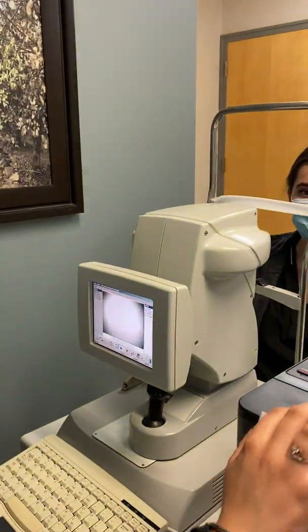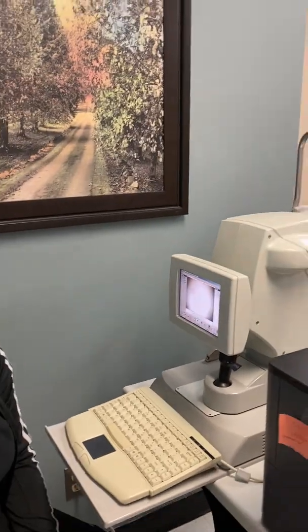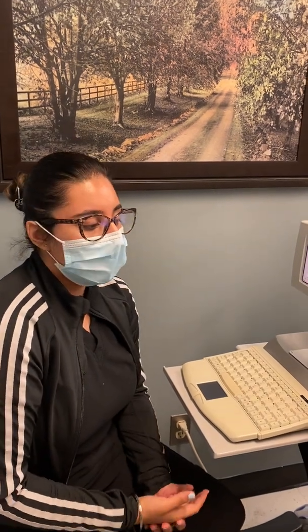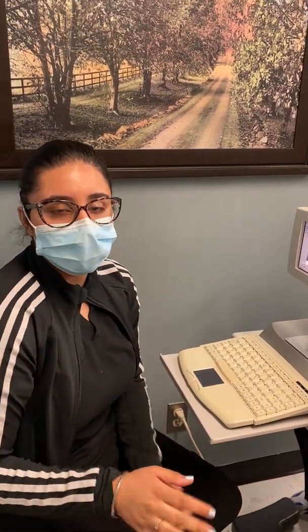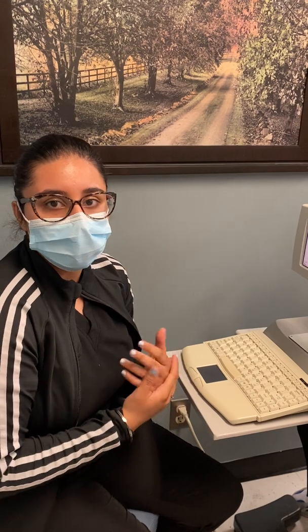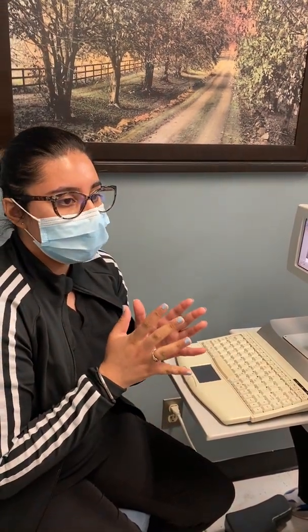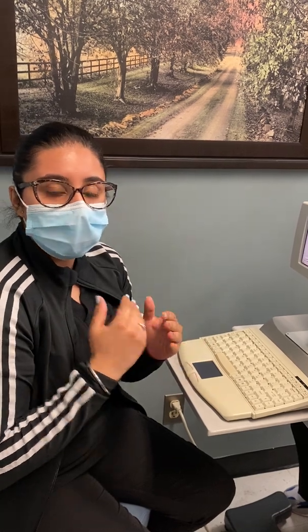All right, anything you want to add, tips? I think the more you practice, the more you get to know. For patients who are quite difficult, or let's say they've got Parkinson's and they've got a lot of movements, just make sure you try to get them as stable as possible. Give them breaks as well.